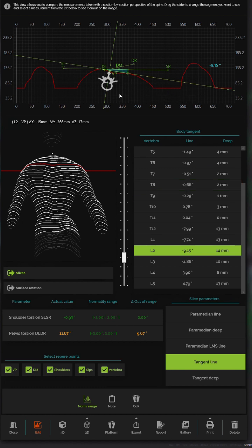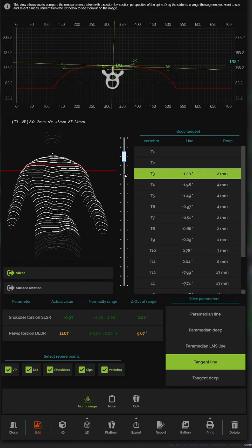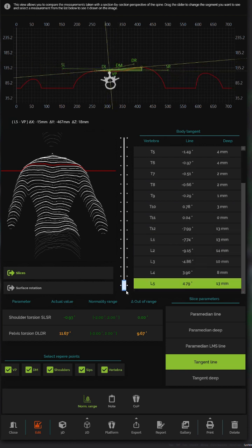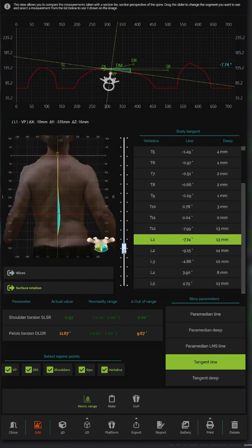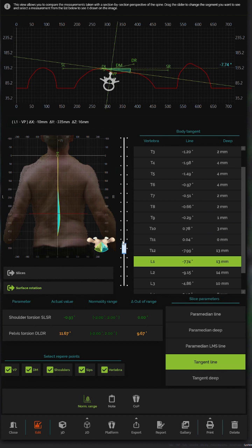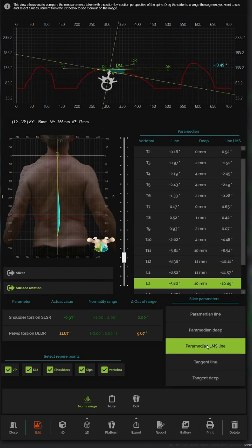And more often than not, if the shoulders and pelvis are not aligned, the spine will corkscrew from one to the other, and those points of excessive torque, particularly around the transitional segments of the CT junction, the thoracolumbar junction, and the lumbosacral junction, then obviously you can get a lot of issues that this torque process can cause, and therefore your management can have significant impacts on that patient's care and quality of life.